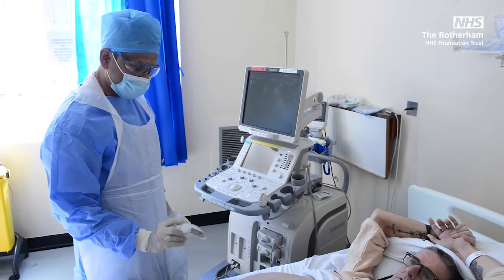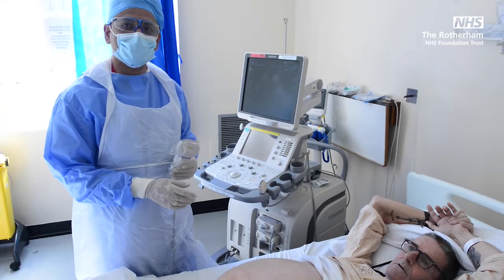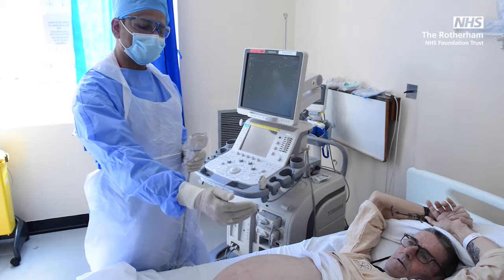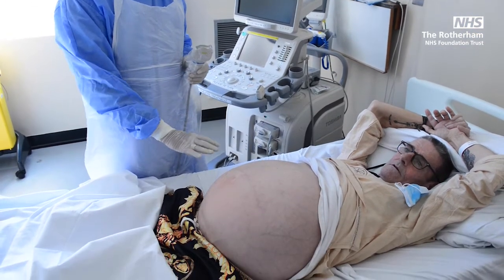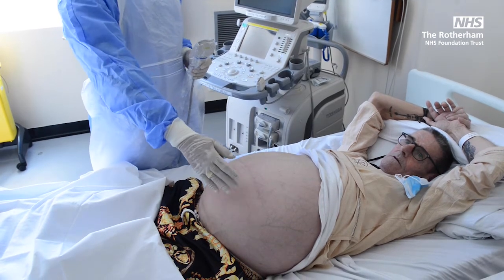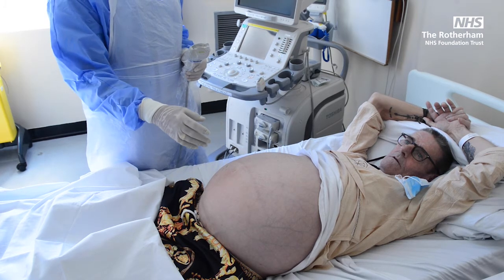So next is to scan the area where you're going to go. Normally with decompensated chronic liver disease, you see that the liver is shrunken because it's cirrhotic, and the spleen has enlarged. So I try to do it on the right side because you're sure that there is not going to be any organs. On the left side, make sure that when you mark the area, there is no spleen interfering there.